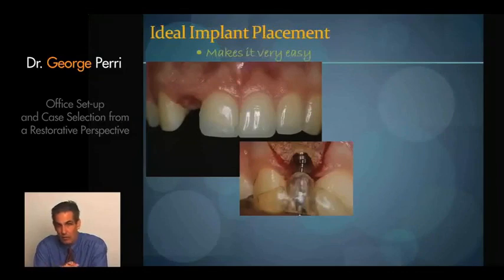But still, we know, and really the things that have been shown to us over the years, is that if the head of the implant is placed in a very narrow parameter of 2, 2.5, maybe 3 millimeters from the desired emergence profile, we will predictably achieve the emergence that we desire on every case. So that common sense thought of sinking the implant further for greater success is absolutely totally wrong. The further the implant head is seated, it may give you comfort right when the implant placement is occurring, but will not give you the restorative success we're looking for.